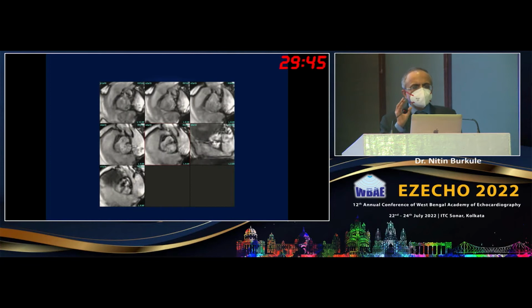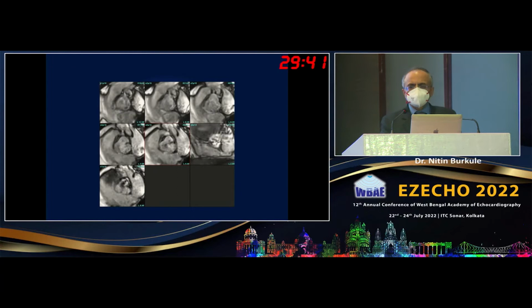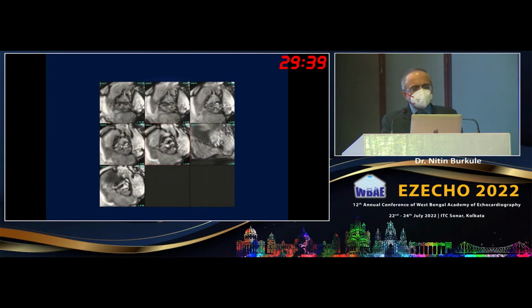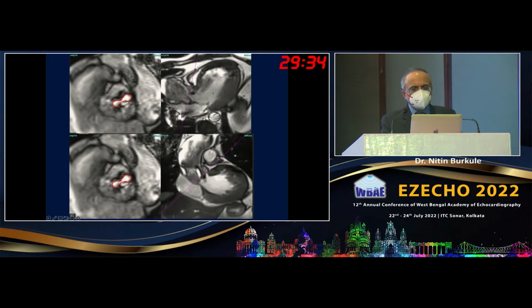Now these images are not very great because the signal to noise ratio is going to be less because the slice thickness is very less. But I know that I am perfectly perpendicular. Why? Because I can see it in two longitudinal planes, one a 3-chamber view and one the coronal view, and I can plan the plane perfectly perpendicular and then take the images around this at 3 millimeter plane, so that I know the plane which at mid systole lies exactly at the tip.